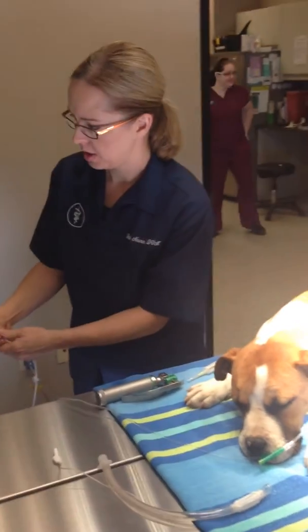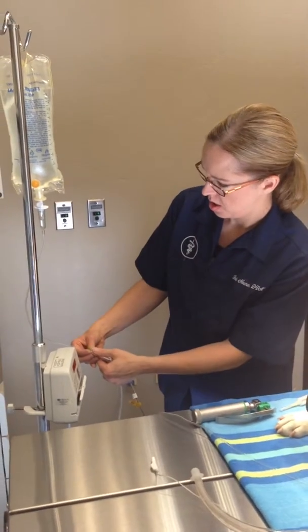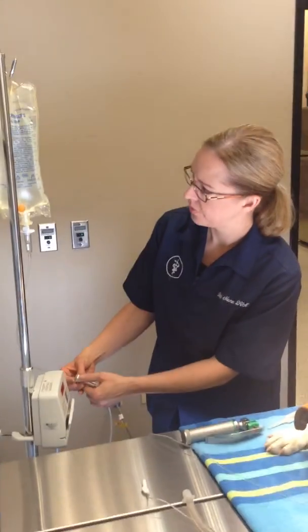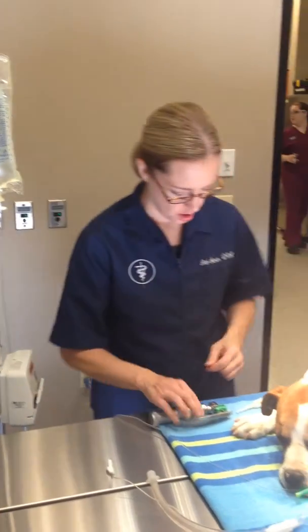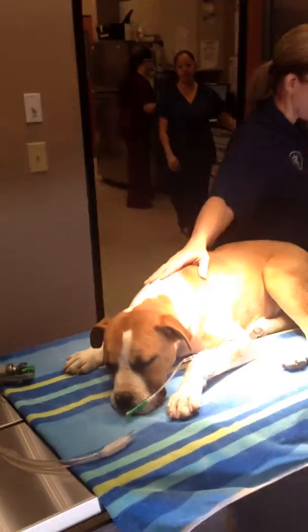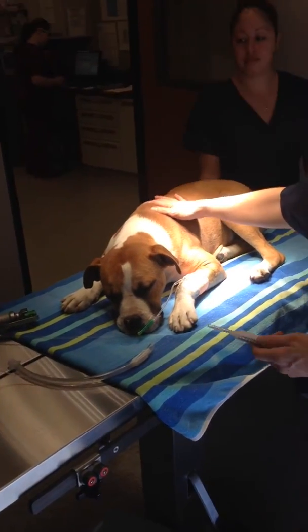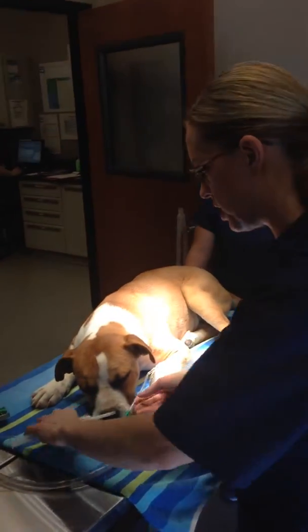We're gonna let his fluids run. Are you ready? You want to help me intubate? He's pretty prepared to go to sleep and have that put in, but we're going to use propofol for induction.